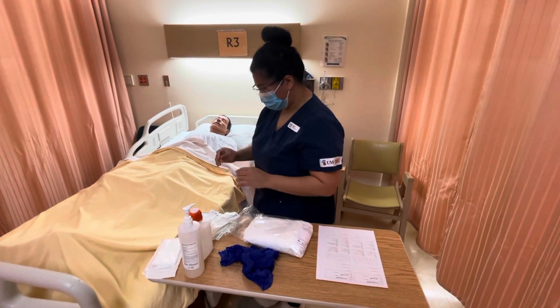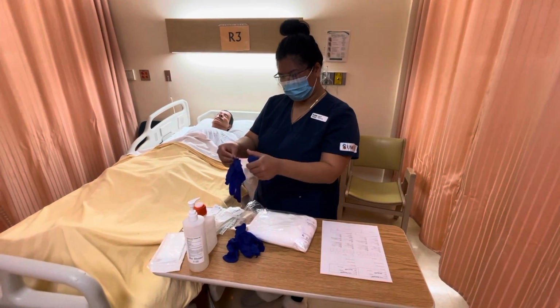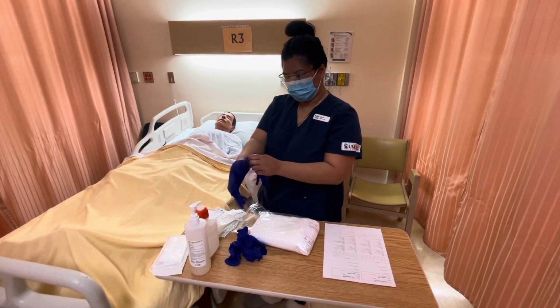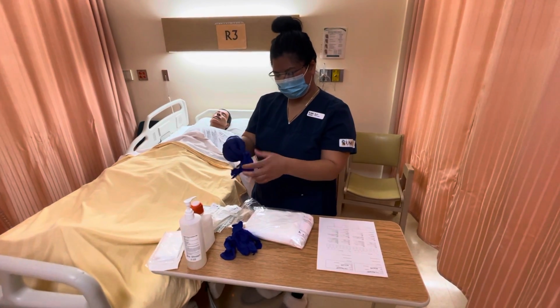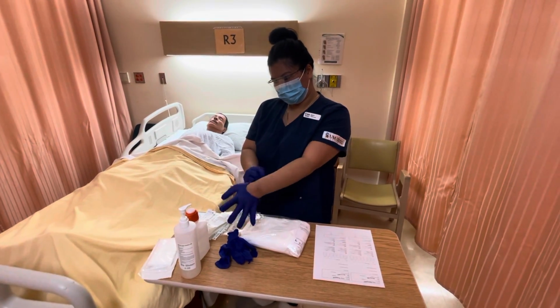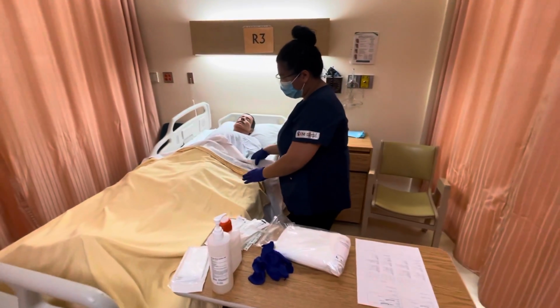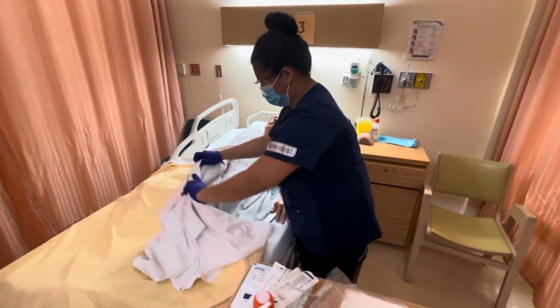And put on a set of gloves. So if there's a little bit of water inside, that's okay.